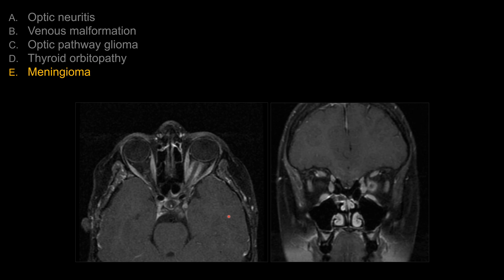For choice B, venous malformation — that's orbital hemangioma. Typically they present with a heterogeneous enhancing mass that's retroorbital, often causing quite a bit of mass effect on the optic nerve and surrounding structures. This lesion here shows circumferential enhancement, so it's not the typical appearance for hemangioma.